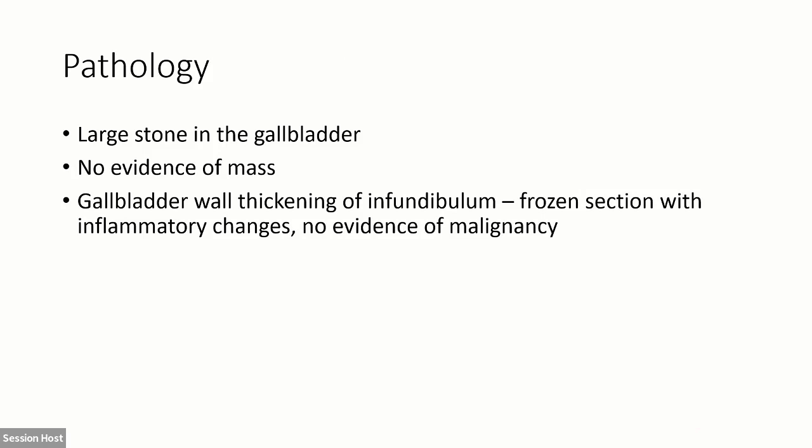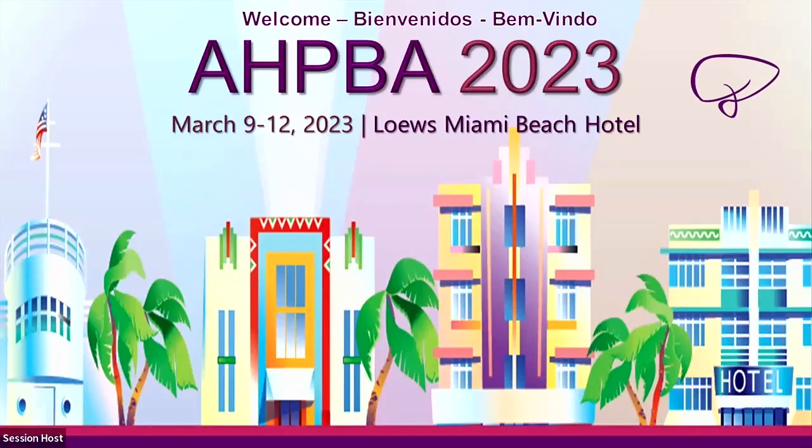Any questions? If you're doing a lot of cholecystectomies, and you think you see a stone, what do you do next? Do you do an intraoperative cholangiogram? A stone in the bile duct. Yeah. So I would do an intraoperative cholangiogram, and then I would get the choledochoscope, the new one, to start trying to see if I can pop it through. I've used that Boston Scientific scope a couple of times, which is what we have available to us. I've done some transampullary dilations and then pushed the stones through, and that's what I've used it for most often.